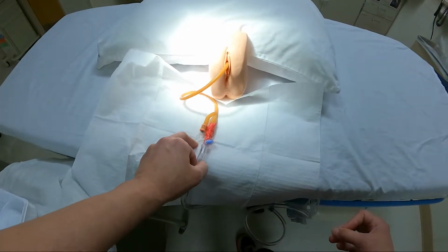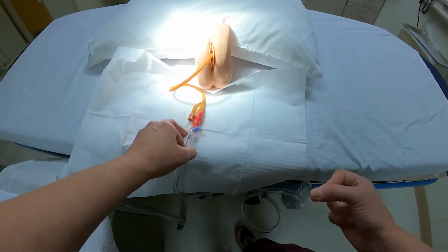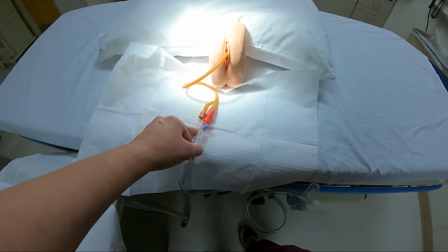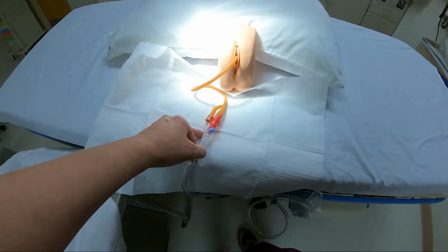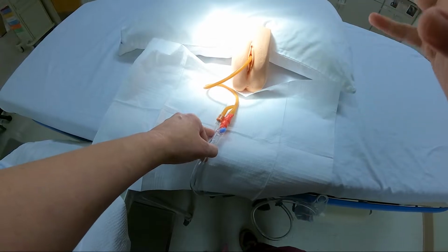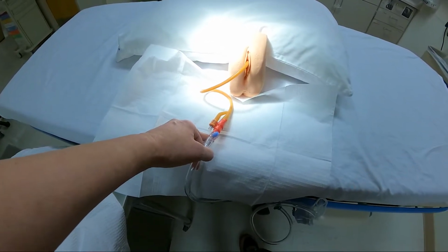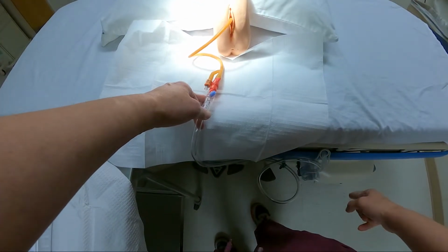Now, there you go. To maintain the catheter, every 24 hours you need to verify that it is still needed. If it's not, talk to the doctor and remove it. If it's still needed, okay. Also, you need to do very good pericare in the morning. So when you're doing their AM and PM wash-ups, make sure you're washing around the catheter and keeping things clean down there. I don't think I need to go into that anymore. You make sure that this is running downhill.